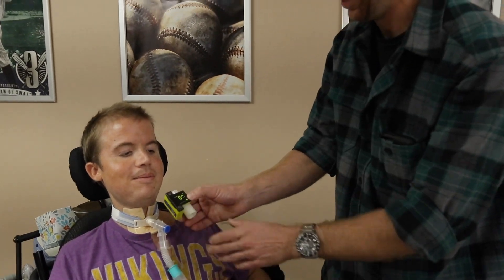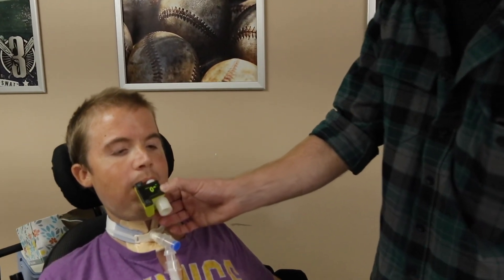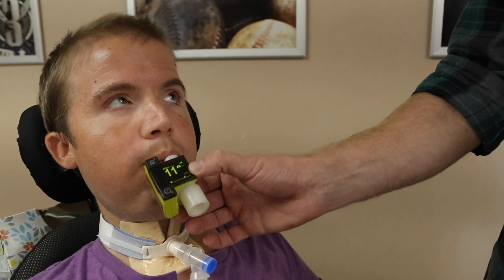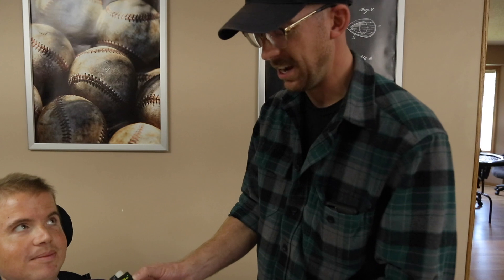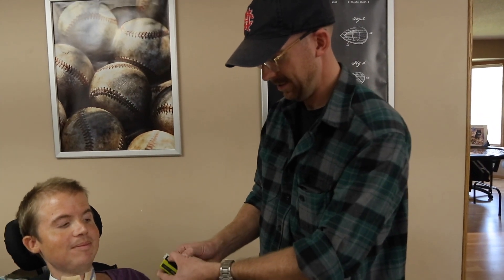As I make his vent mad — go ahead and blow — you can see all of his exhaled CO2 is coming through his mouth right now, not through the vent circuit. So later we'll do another shot and we'll actually put his balloon up and then attach this again to see what happens.